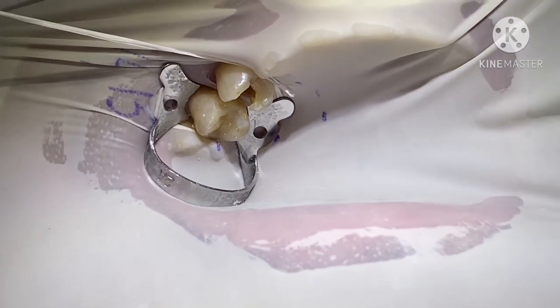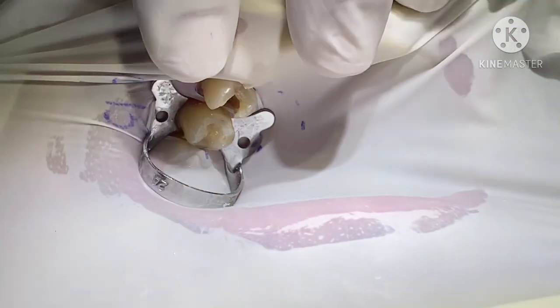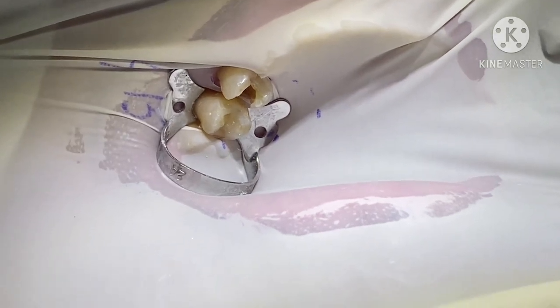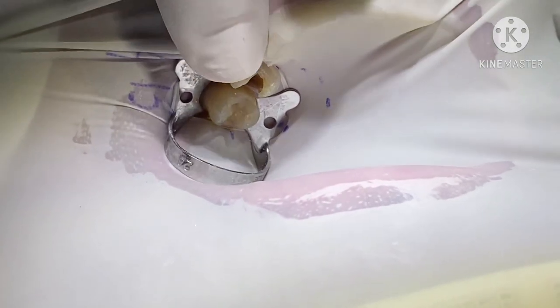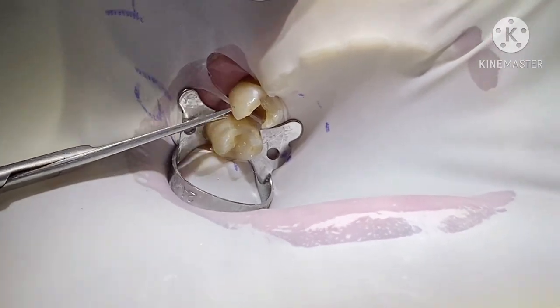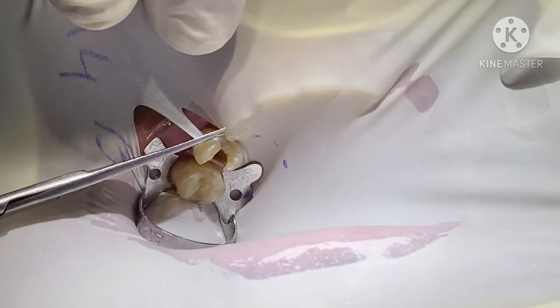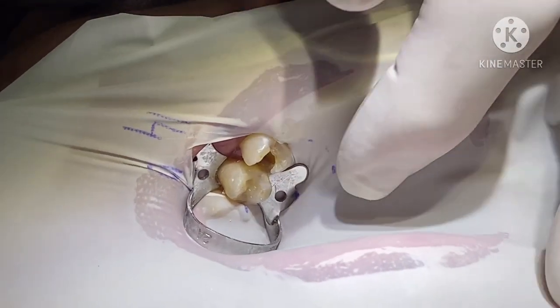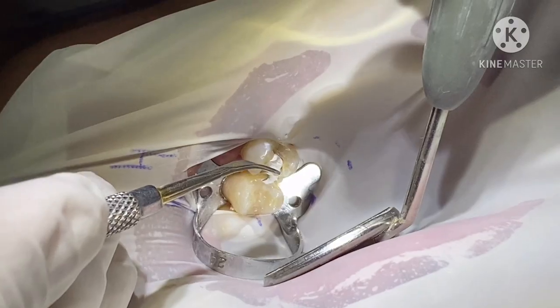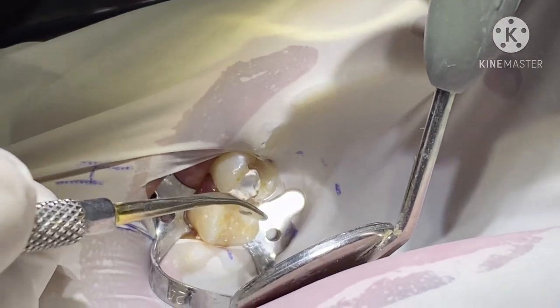Do the temporary filling. We remove this first, right? Then we have to cut the stretch of the rubber dam that extends between the interdental space like this. So that the temporary filling doesn't come out. Now we do the temporary filling.